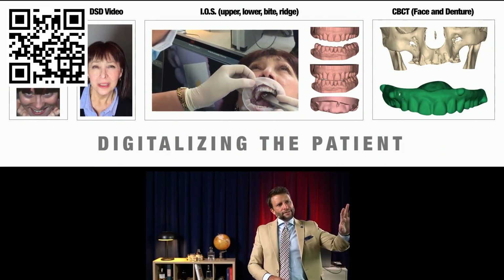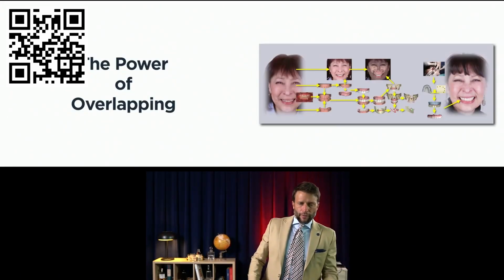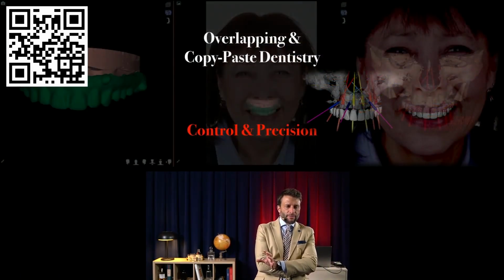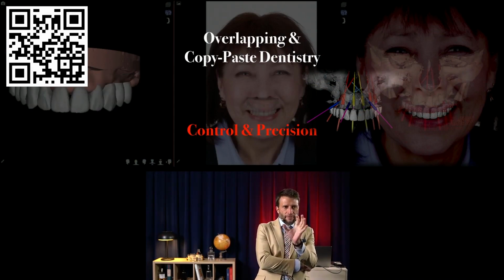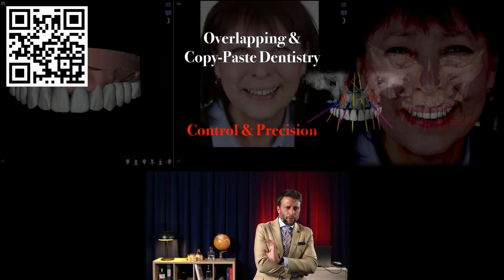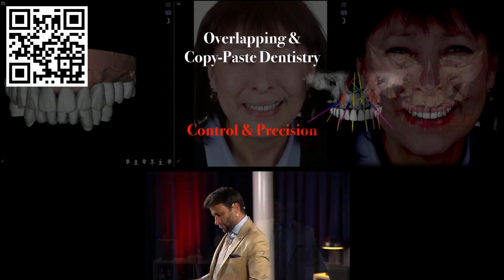So you see the 5 DSD photos. So this is why we talk about overlapping. And it's a very important concept for you to understand. Even though you may never ever have to work on the computer yourself doing it, it's very important to understand the importance of overlapping files.